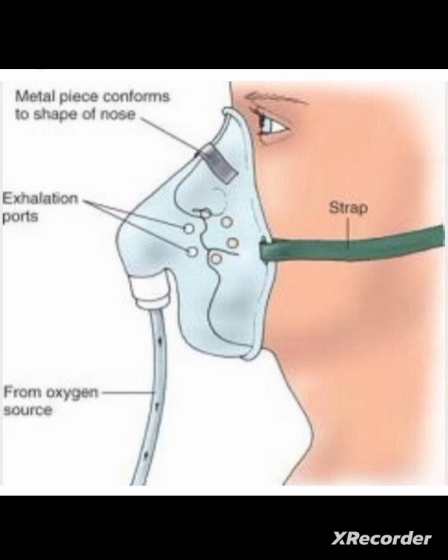O2 concentration here is 30 to 50% and the flow rate will be 6 to 12 liters per minute. The mask needs adequate humidification.